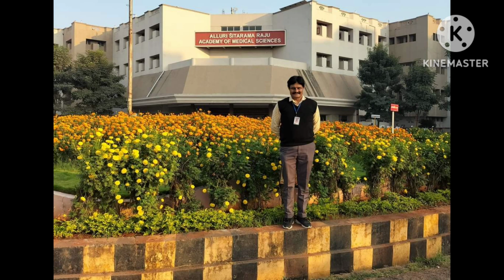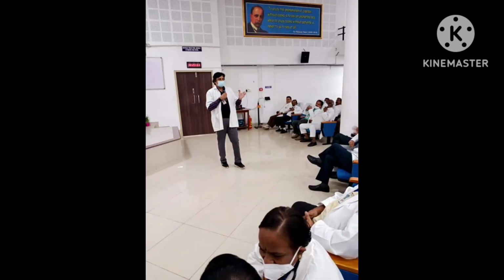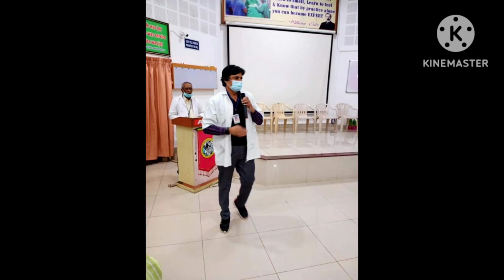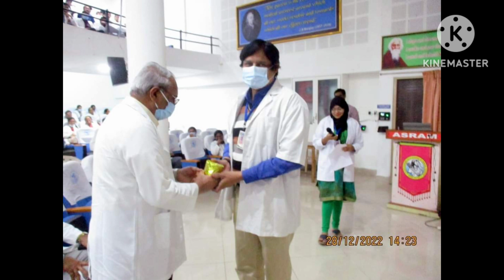The increase in cardiac output with the intra-aortic balloon pump is between 0.5 to 1 liter per minute. As I mentioned, contraindications of IABP could be uncontrolled sepsis, uncontrolled bleeding diathesis, or moderate to severe aortic regurgitation, which I just mentioned.